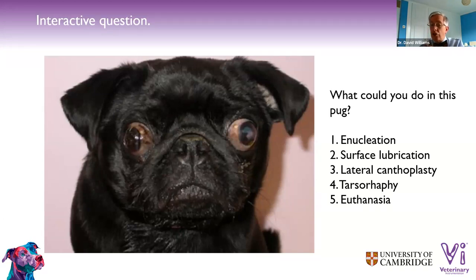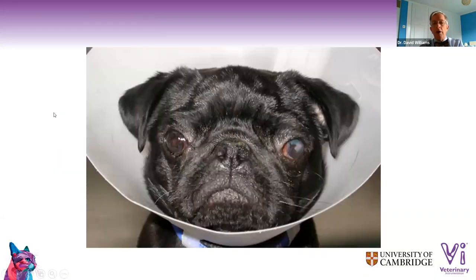And look, do that. And as he wakes up, come on, Basil, wake up. Anyway, so there's Basil as he woke up from his surgery. And now, those of you who put surface lubrication, absolutely, every pug needs surface lubrication from day one, as far as I can see. But actually, really, by closing down the amount of palpebral aperture, let me just go back to show you where he was before.